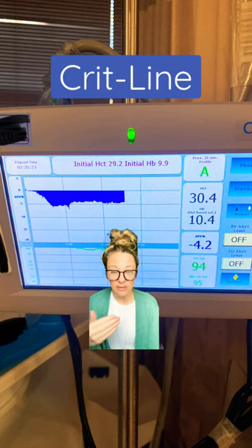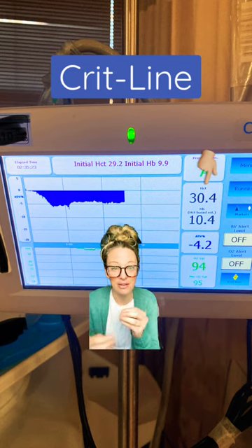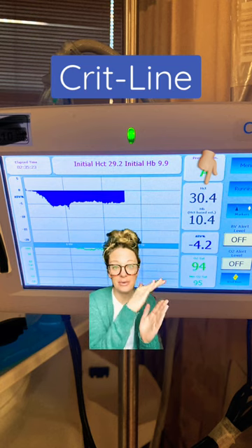As we remove fluid from the patient, their blood is going to be less diluted, so it's going to be more concentrated with hematocrit and hemoglobin. We're about two and a half hours into treatment, and we can see that those numbers have gone up.